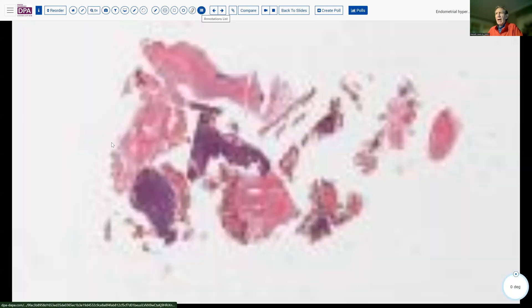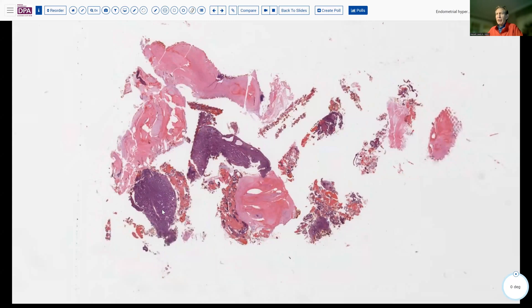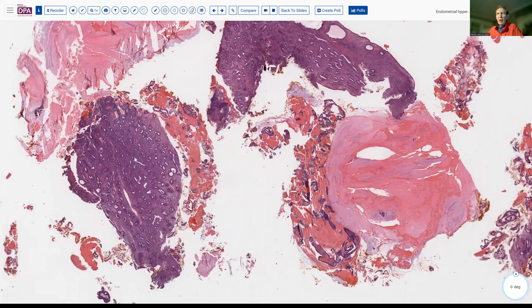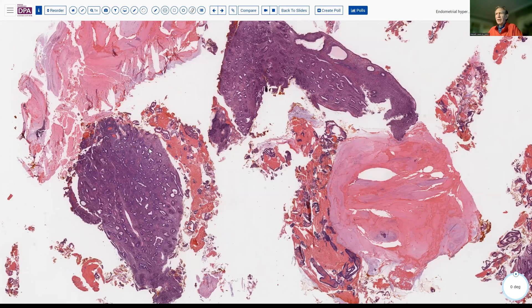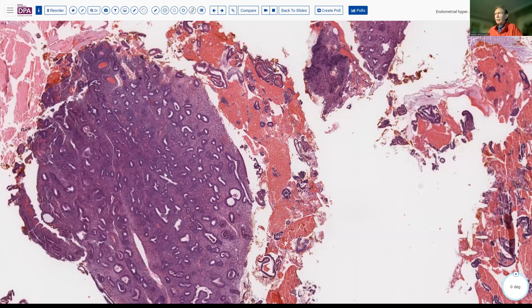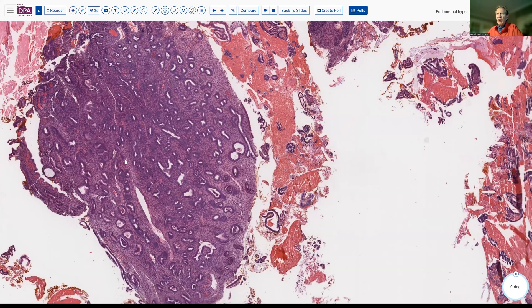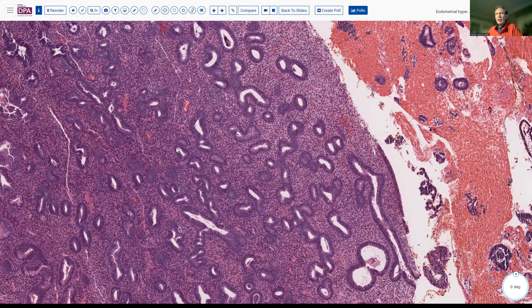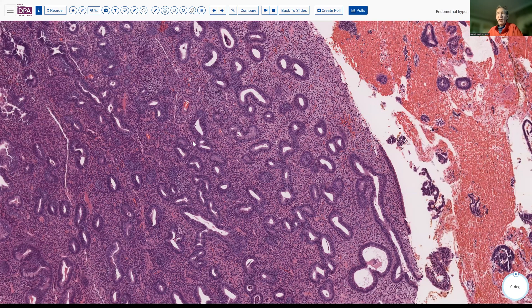This issue came to light when a particular sample was referred to us from an outside hospital who had, in turn, consulted a colleague at a well-known institution. As you can see, at low magnification, these are two sort of chunky fragments of tissue, with a little bit of glandular dilatation, not a whole lot of crowding of these glands, and not a lot of normal background endometrium to compare them with. Could this be a polyp? There are some vessels. Could it be hyperplasia? There are certainly some irregularities to the architecture. The referring pathologist was justifiably concerned, but perhaps not overly worried about the lesion based on the relative proportion.